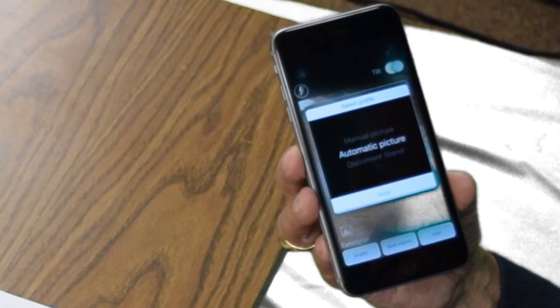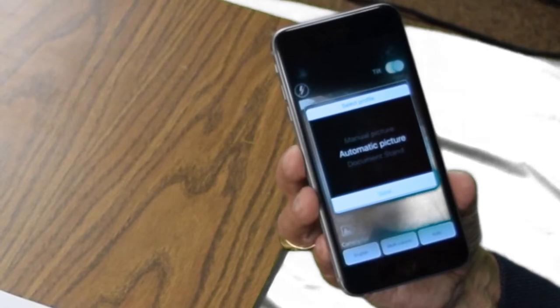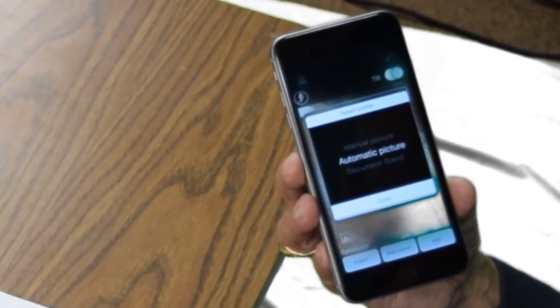Select Profile is showing Manual Picture. There are three choices here — this is an adjustable field. It was set to Manual Picture. If I swipe up once, I get Automatic Picture, which we'll cover in another lesson. And if I swipe up one more time, I get Document Stand. So you have Manual, Automatic, or Document Stand.